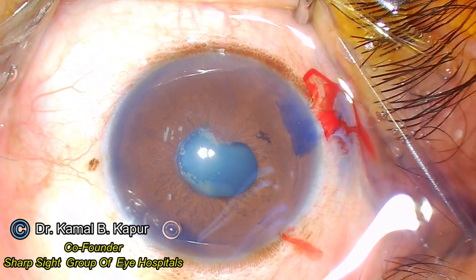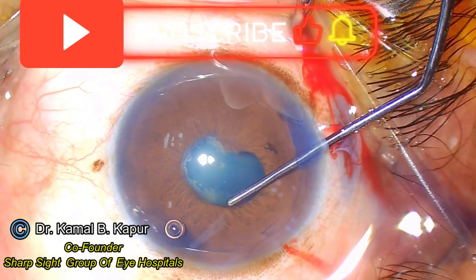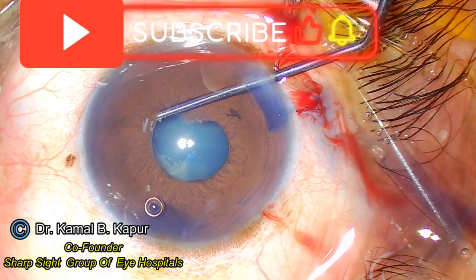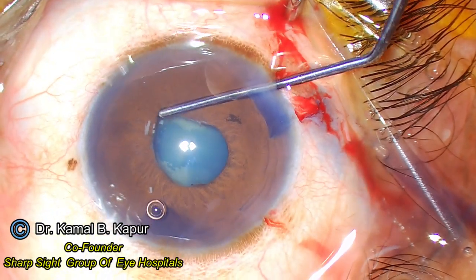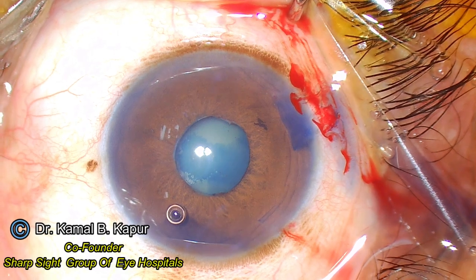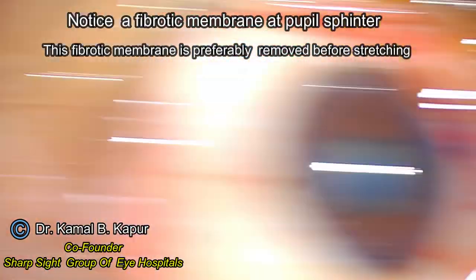We ensure that we stain the capsule by pushing some dye underneath the pupillary opening. After that, we very gently, after installation of viscoelastic, break the adhesions. Once we are ensured that the adhesions of the posterior synechiae have been broken, we instill viscoelastic into the anterior chamber and now we will use two instruments.